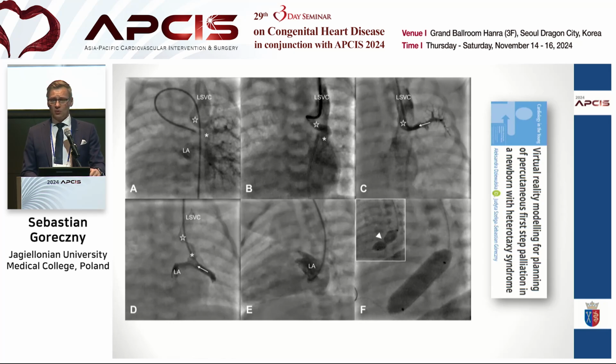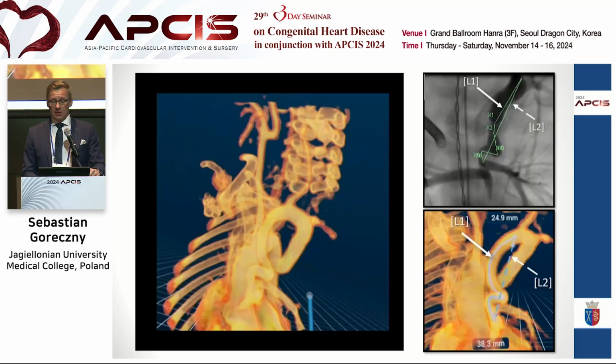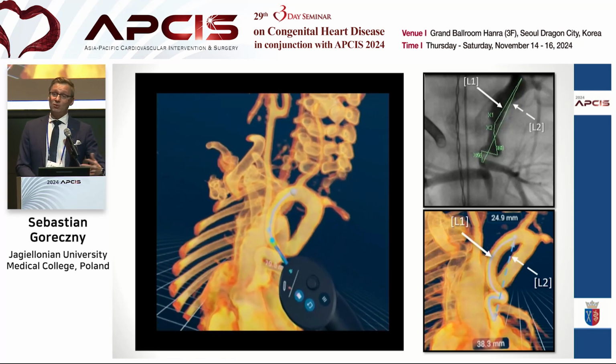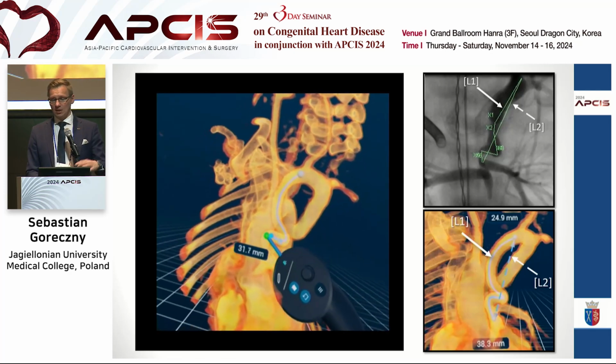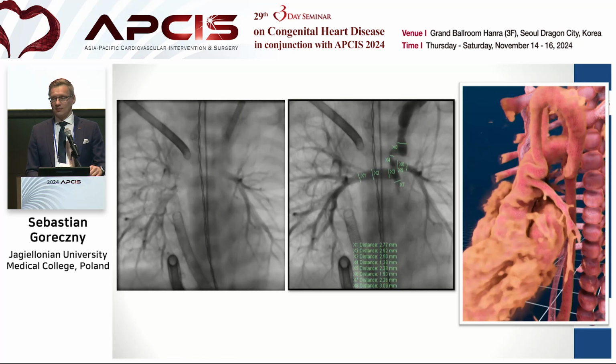So no 3D imaging for this particular patient in the lab, but nice imaging before. Okay, this was initially PDA stenting. I declined that at our surgical meeting. Well, I was hesitant, and the surgeon said, okay, I'm going to do it, I'm going to put a central shunt there. Well, as you can see, that wasn't the case, because in the middle of that surgery, he called for assistance, and he said, I placed a sheath for you. Can you place a stent?